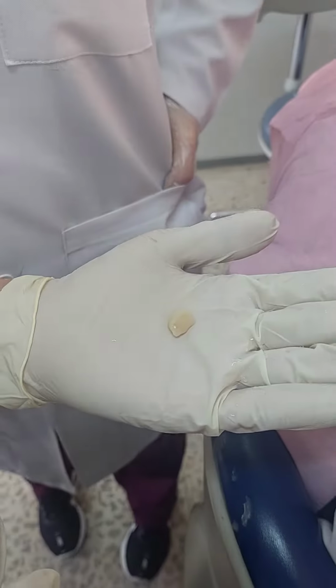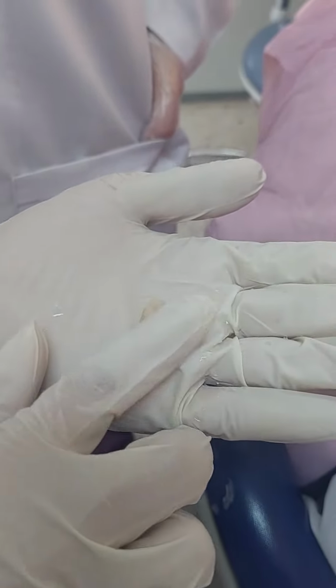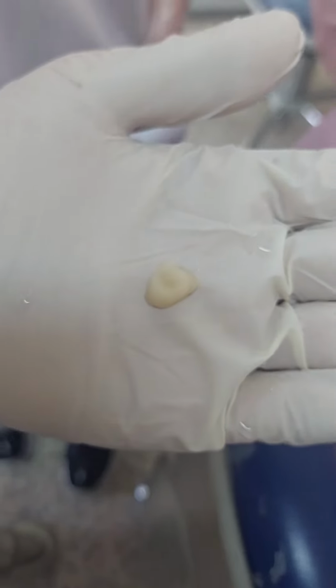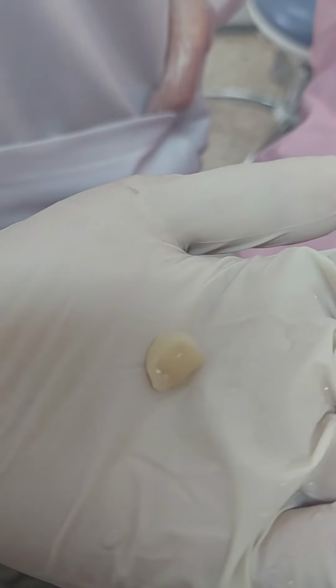This is a temporary material. Okay, let me just focus. Okay, this is a temporary. Show me the occlusal surface, please. The student was working with it and she removed the excess. But look from the inside. Show me from the inside. It's filled. There are no empty spaces.